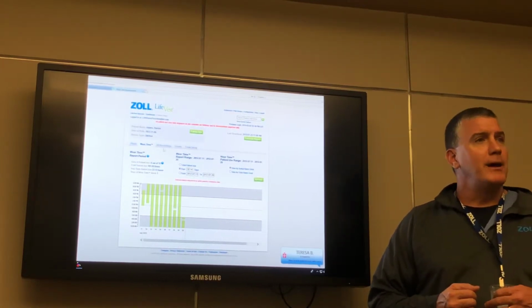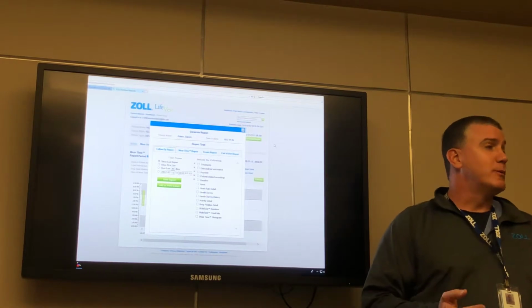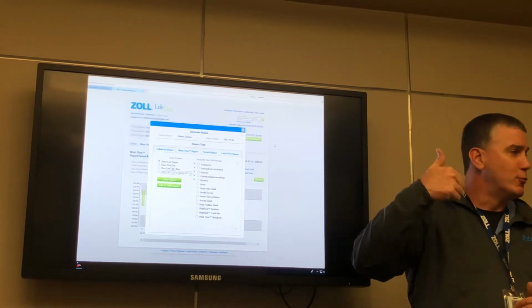Are you wearing it all the time? Oh, sure I am. Well, all these days here show you're not wearing it. And so what that shows us, for those patients that we do that to, the clinics actually do that, we see our compliance level go up through the roof.